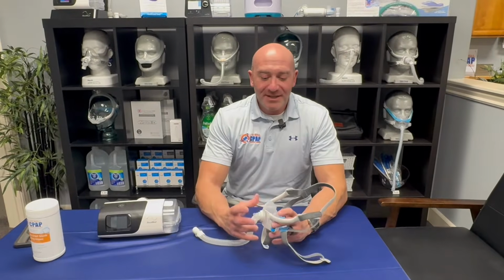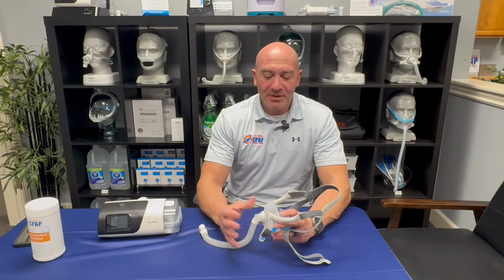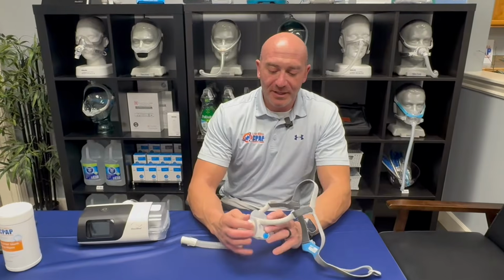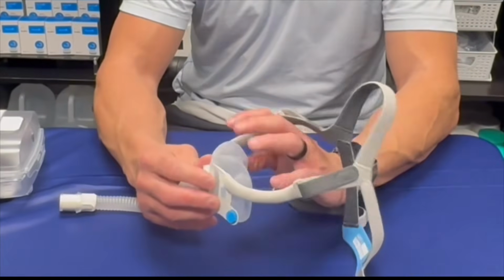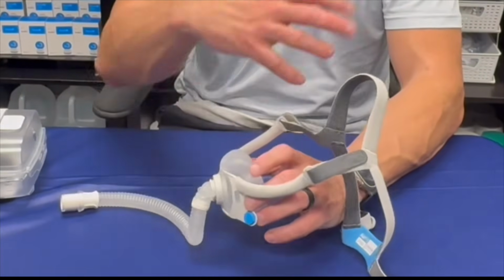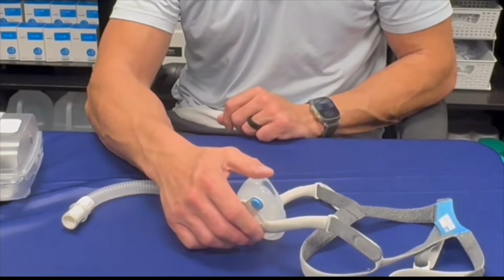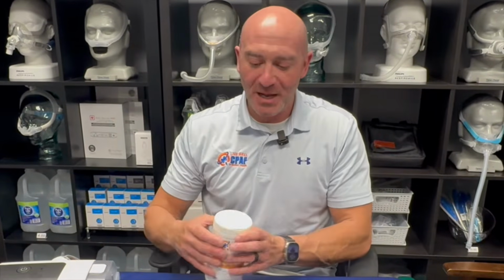So we're going to go over maintenance of the masks, and there's some ways to make this a little bit faster. So typically, the standard recommendation is to clean these cushions and everything daily. I know for a lot of people that can be a little taxing. You don't want to wake up 2 hours earlier just to clean all your maintenance. So they do make things like CPAP wipes here. You can see this is kind of my company's CPAP wipe. Pops up. You can also use baby wipes.